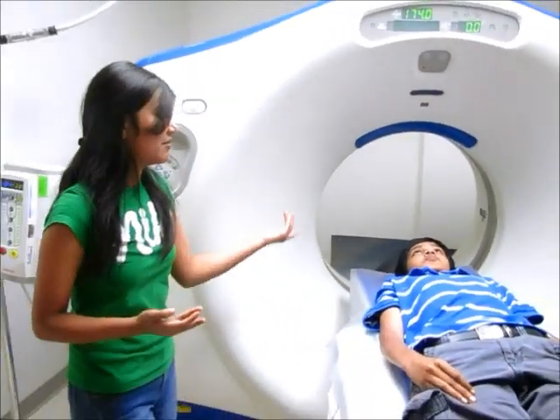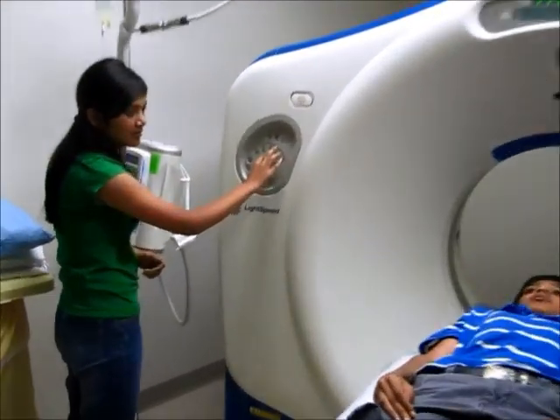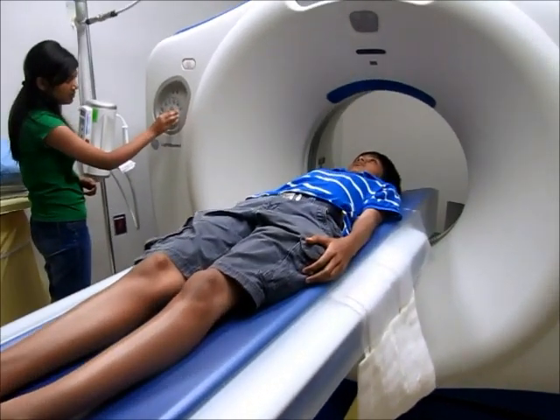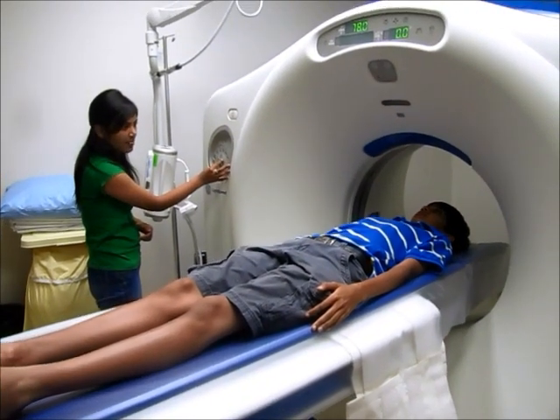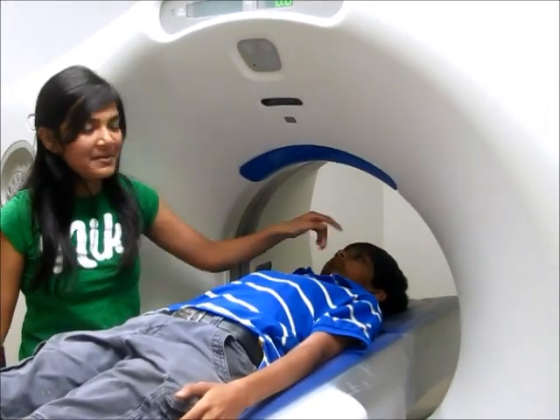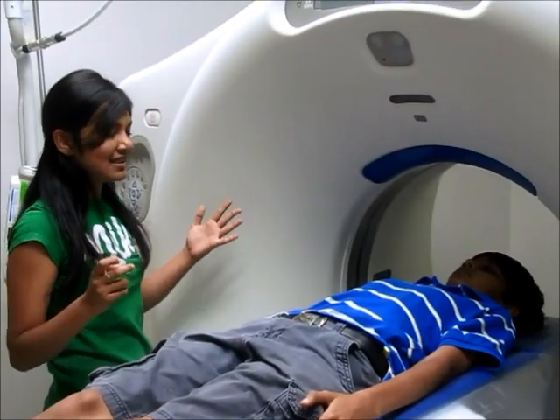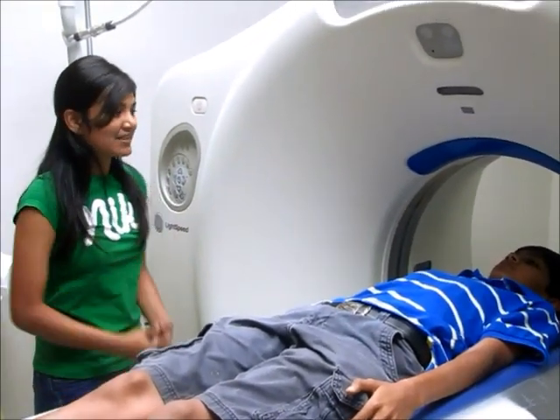Let's say Mitt had something wrong with his brain. This is how it would be. You can see that now his brain, or where his brain would be, is in this circle. When the doctors press the button, there would be a red light coming and the CT scan machine would take a picture of his brain. And then in a few hours, the doctors can see if there's anything wrong with your brain.